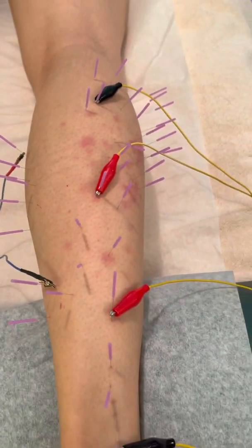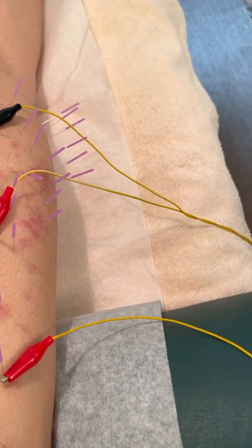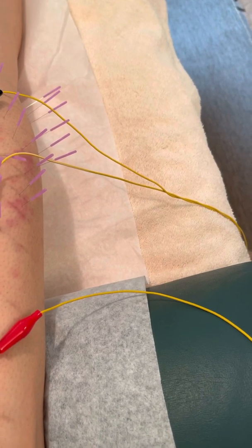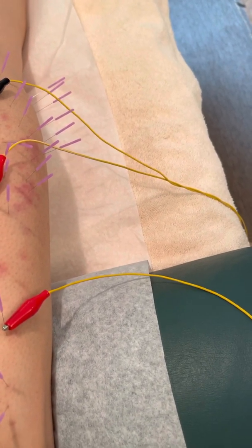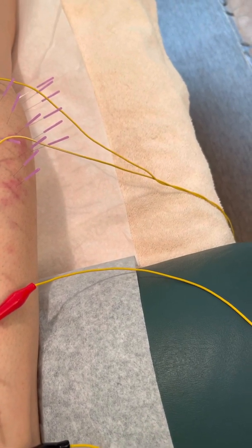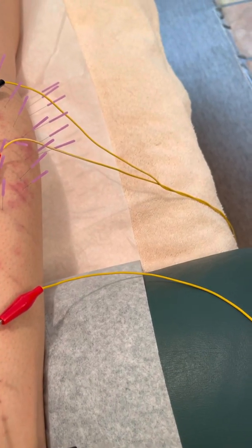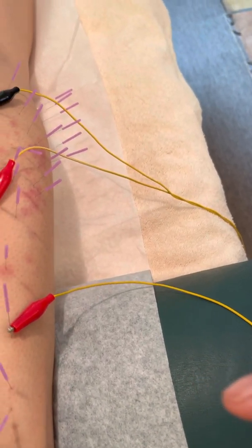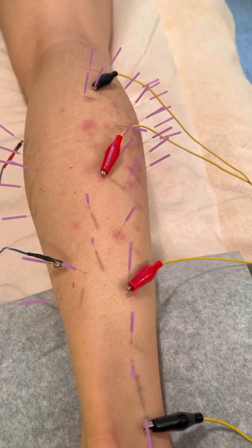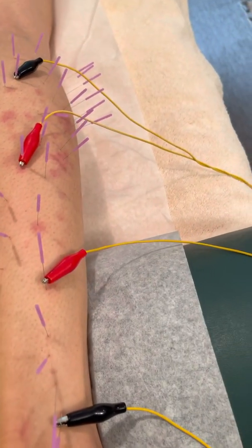There's also a mixed mode that I'm going to do now. So I'm going to have to lower these a little bit, because when I do the mixed mode, it makes it really strong and you won't like it. So let me lower these. Now move it into the mixed mode. And in the mixed mode, see, in a regular mode the body can get used to it. The mixed mode, instead of going dot, dot, dot, dot, dot, goes dot, dot, zzz, dot, dot, zzz. So try this and see what you think.